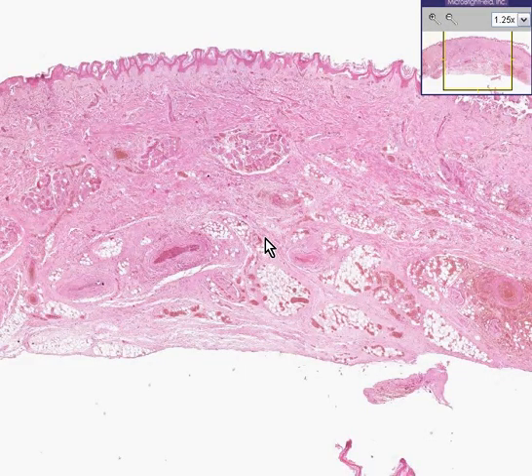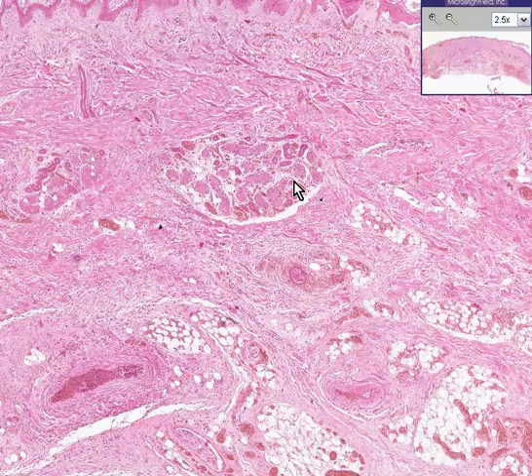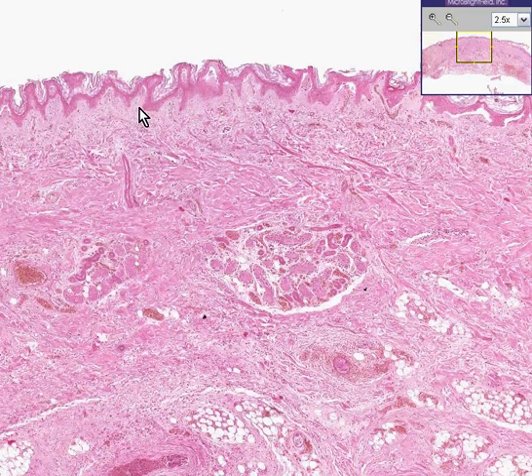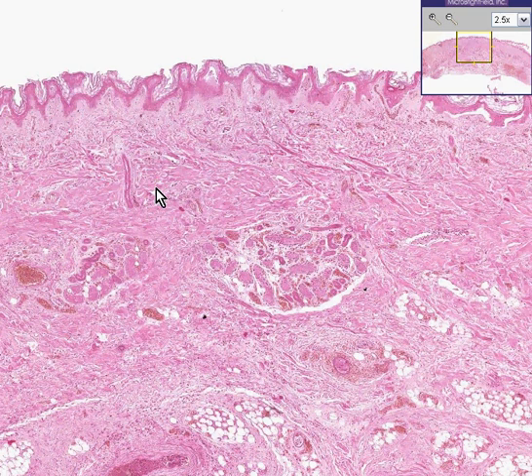What can we say that we have here? Very easily we can say that it is skin, because even at this power you could recognize an epidermis, you could recognize some stratum corneum layers, you could recognize the papillary dermis between the rete pegs of the skin, and then you could recognize a denser, more thick-banded collagenous bundles of the reticular dermis.